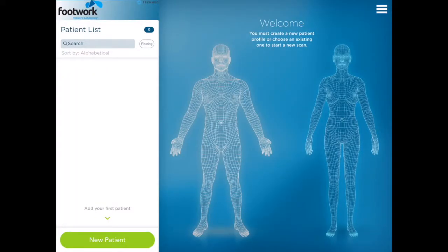Hi, Arthur here from Footwork. Today we are here to show you how to use the new updated scanning app based on the Structure Scanner along with the use of an iPad.